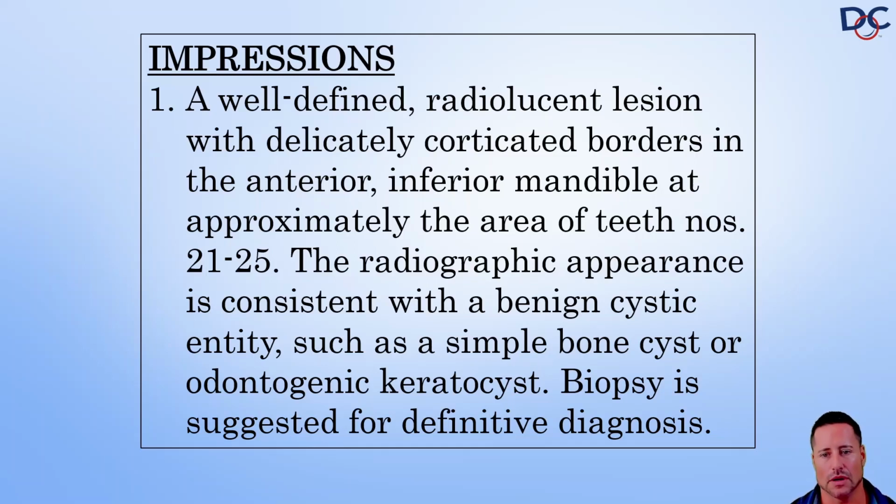Some people, and actually after this, what I would start to do, and some people advocate for this, is when you see that, you can just refer it right to the oral surgeon. Oftentimes, they're going to take it and get it read, so that becomes a preference, because obviously that case was going to have to see an oral surgeon at some point anyway, so you could certainly do that as well. But you can see it's not anything you should be intimidated by or scared of, to look at these images and do the majority of diagnostics yourself, but when you need assistance or help, be able to make that referral.